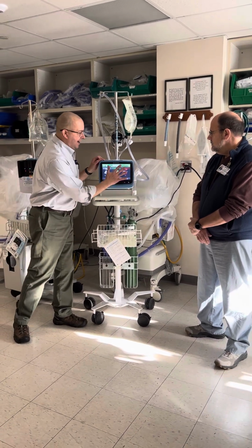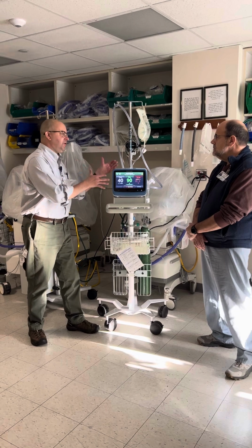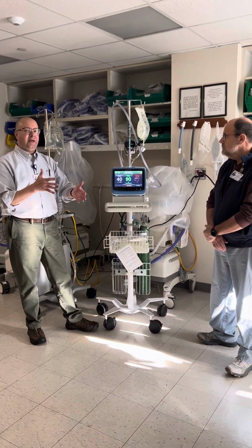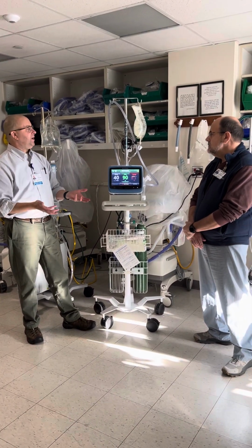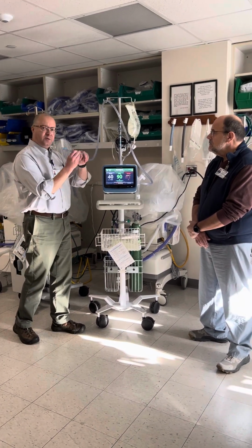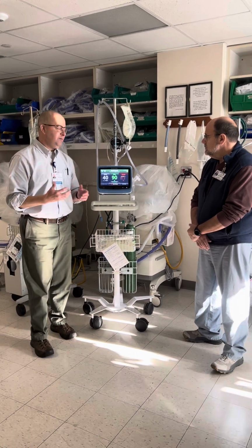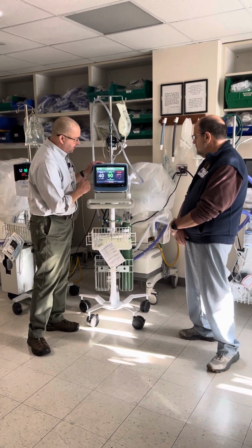Right now, because I had this on standby, it's heating back up, but the same idea. It might be 33 to 37 or 38 degrees Celsius, depending on what the patient will tolerate. The circuit is a little bit more flexible than the other circuit, but the cannula doesn't change. It's exactly the same. All the other parameters are the same on the unit.